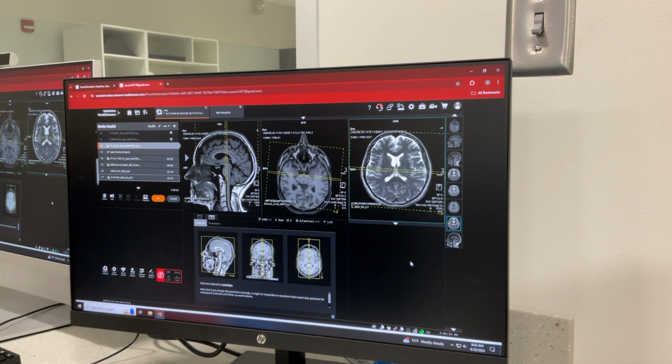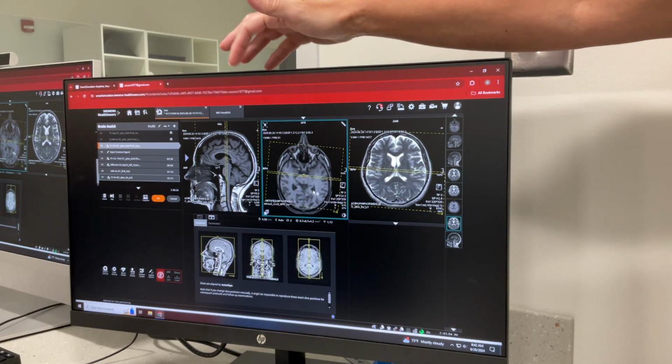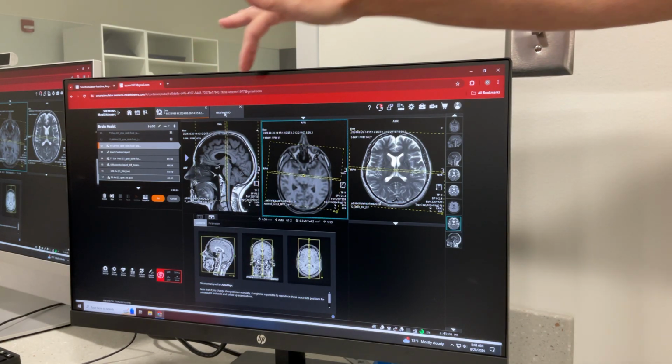Now we're getting ready to set up a coronal, so we would like to have that coronal image back, right? It automatically disappears on this sometimes. So what you can do is go to your view and go.